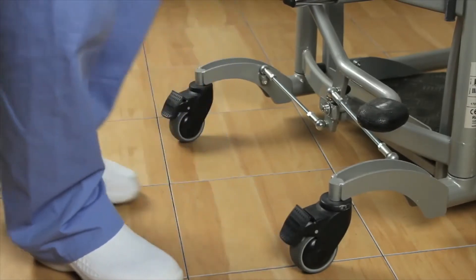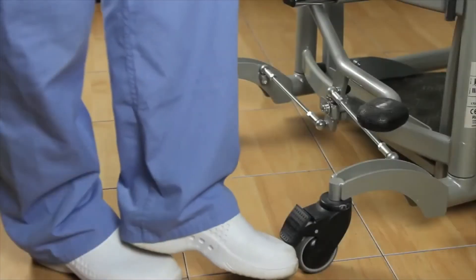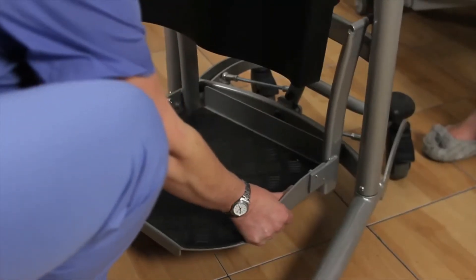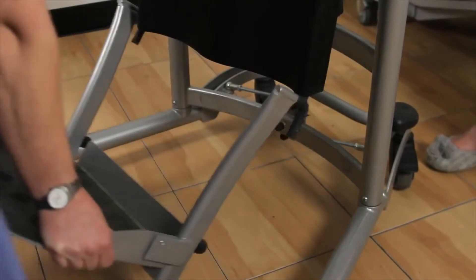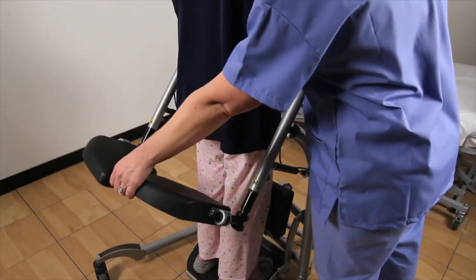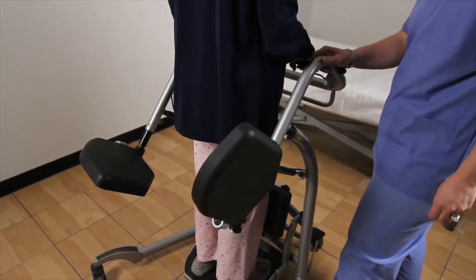To lock the brakes, push down with your foot on the brake pedal. Brakes should be locked on both sides. To unlock the brakes, push forward on the brake pedal. The footplate is easy to take off and put back on, which allows for ambulating as well as for cleaning. The seat cushions are easy to fold up and down to allow the patient to stand and then sit.